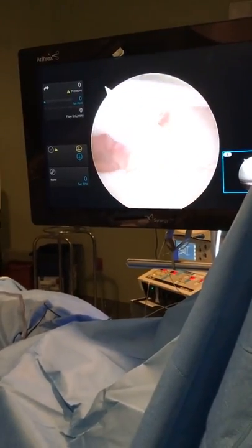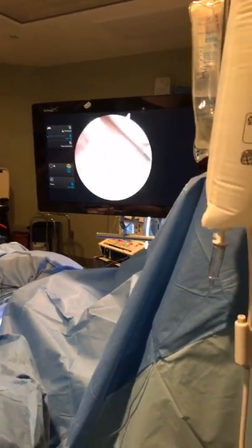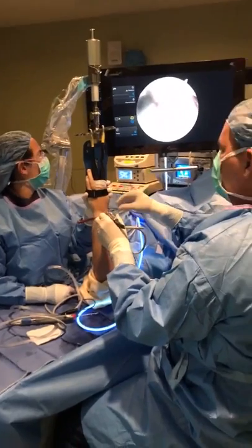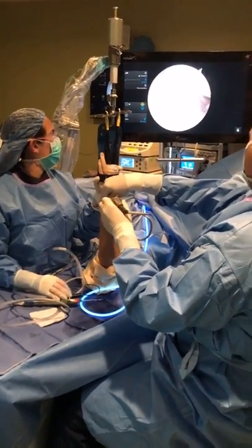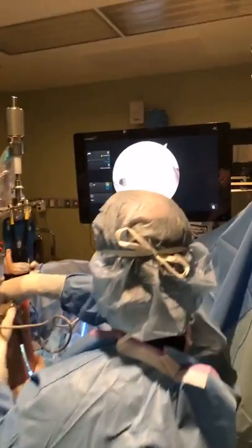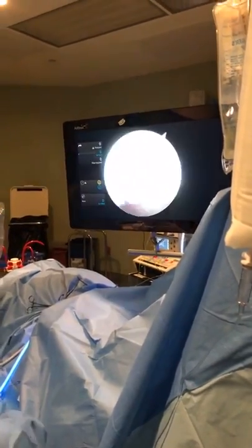Okay. So you can see these kind of surgeries require two people because I need my hands. Kate is vital, isn't she? It has to be somebody with experience because she knows my next steps. So these ligaments are perfect, right? You don't have to be a specialist to realize this looks pretty good. Nice, really a veil of tissue which is stabilizing this part of the wrist.